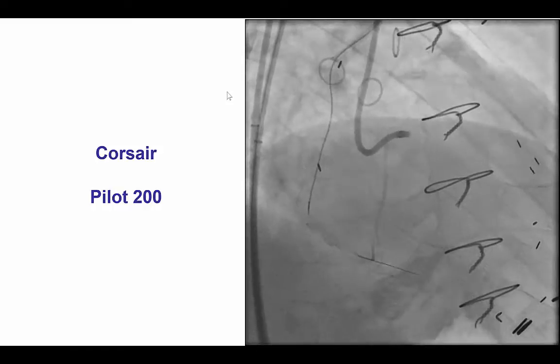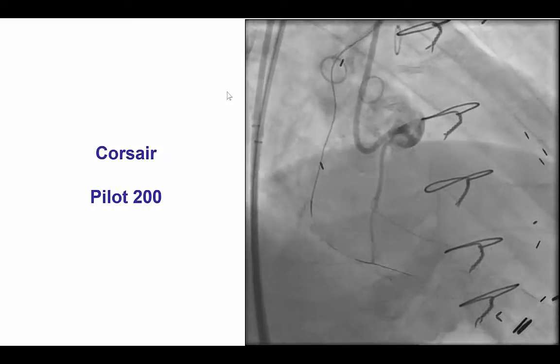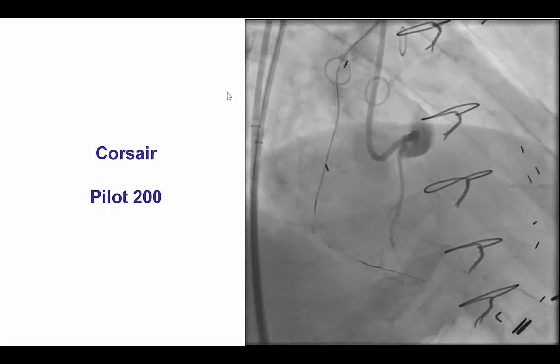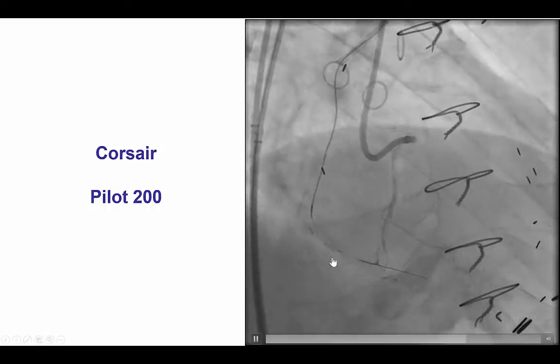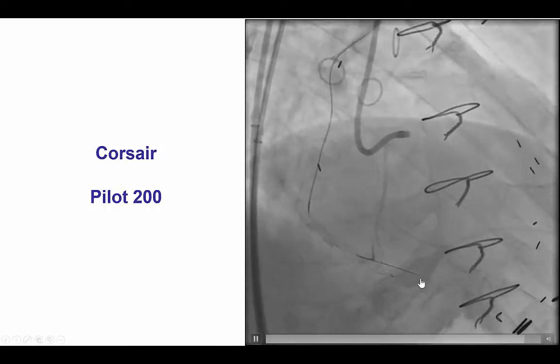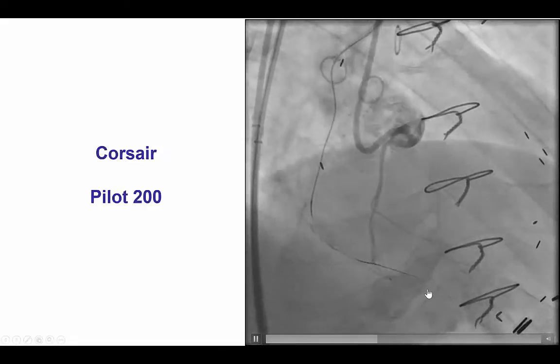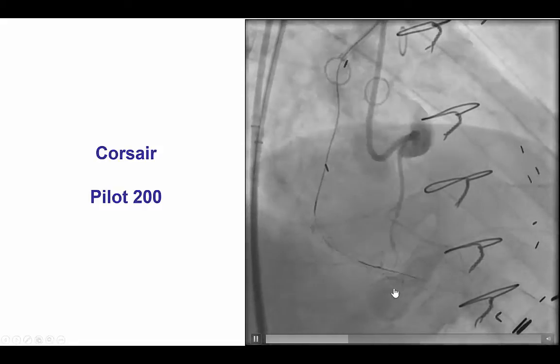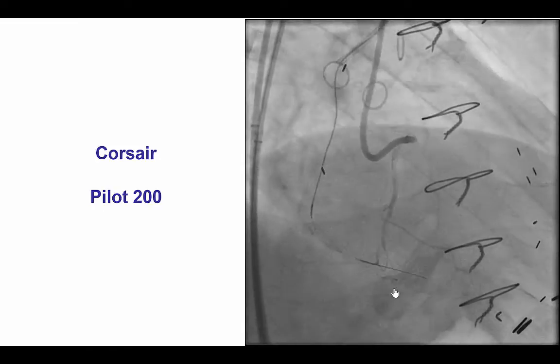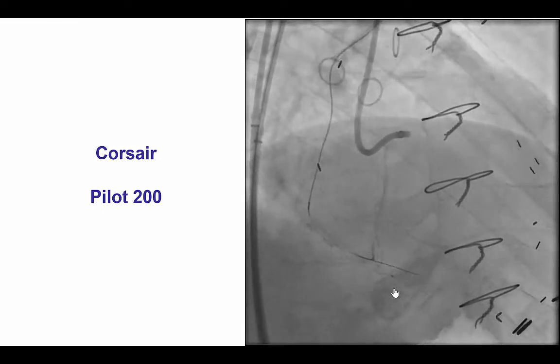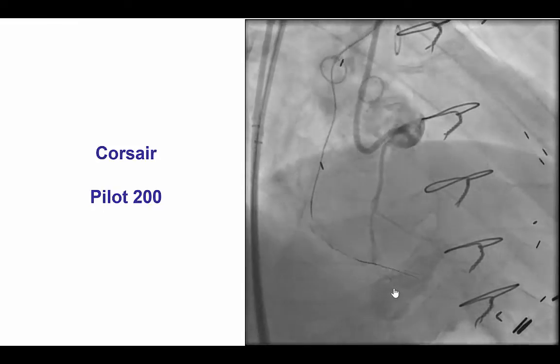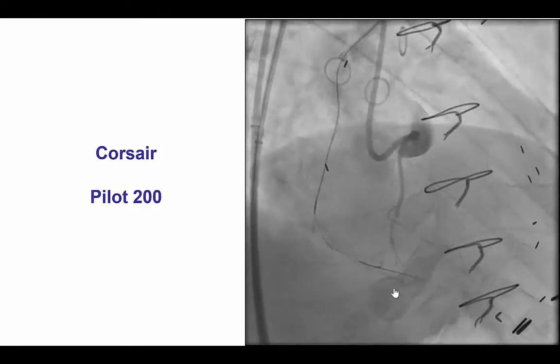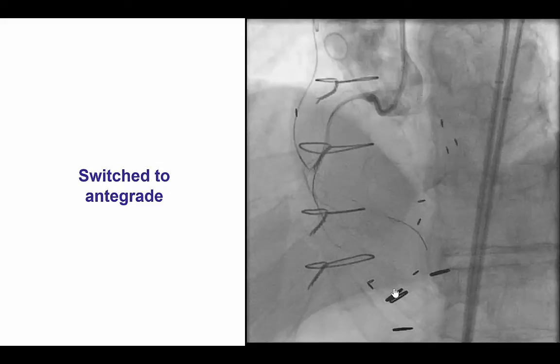We first tried to go retrograde through the vein graft. This is typically done using a Corsair microcatheter and a Pilot 200 guide wire, which advanced very nicely. However, upon entering the distal vessel, we could not go backwards into the posterior descending artery. This is a common problem when retrograde PCI is done through vein grafts — sometimes the touchdown can be at an acute angle, making it very hard to go backwards.